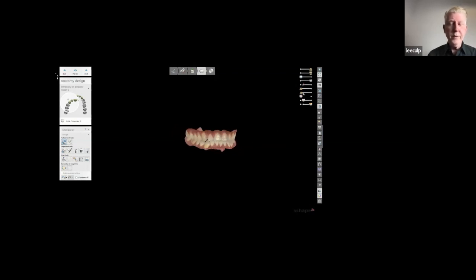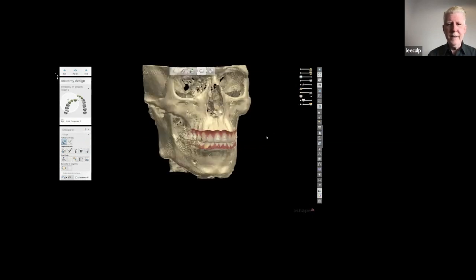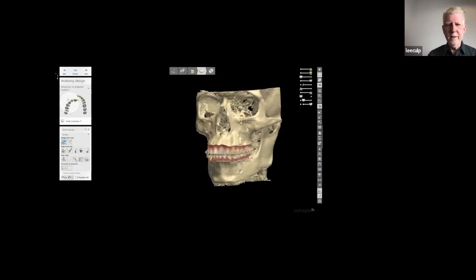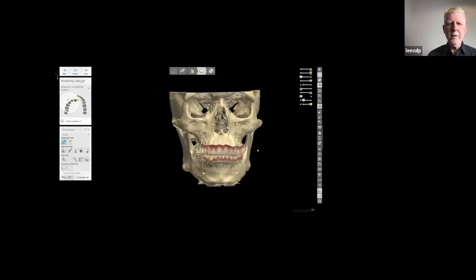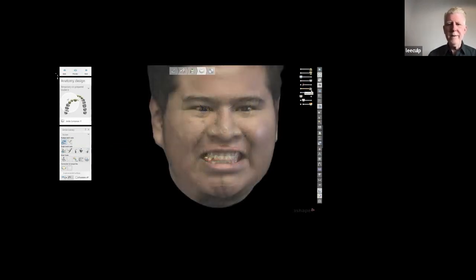And it was a phone app, worked very nicely. We could tie the CTs into it. So we could do an intraoral and a CT scan, tie all that in, and then put the face on top of it. It helps for positioning on the digital articulator. There were a lot of things that we could do with this data that we still can do today.